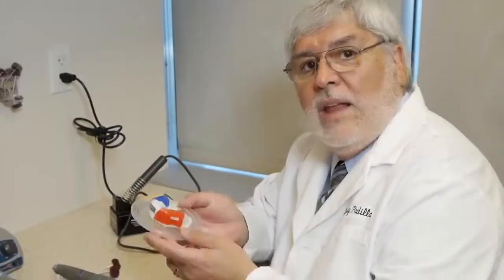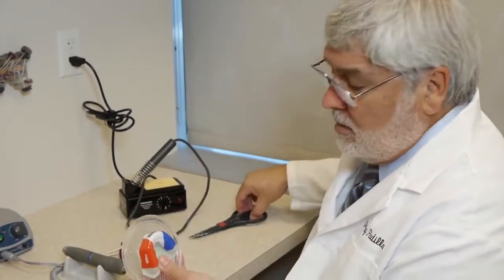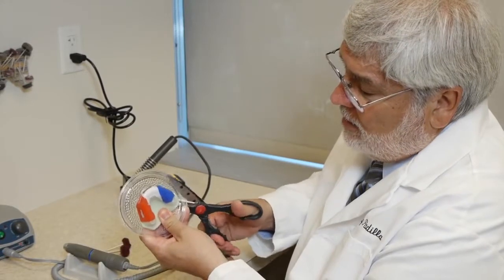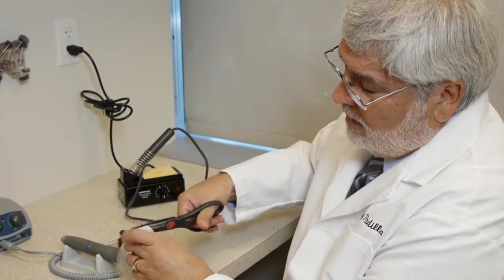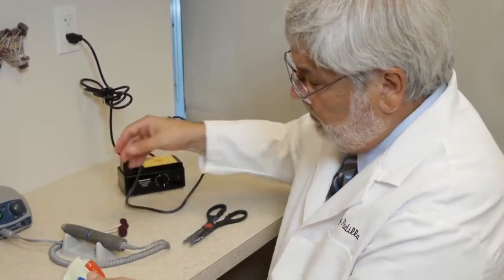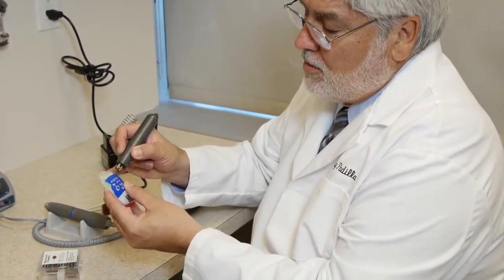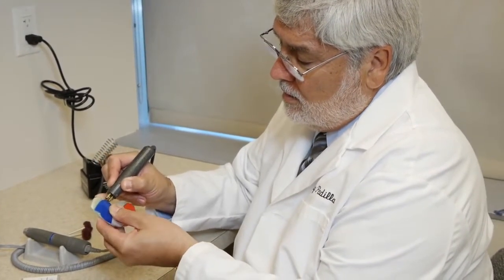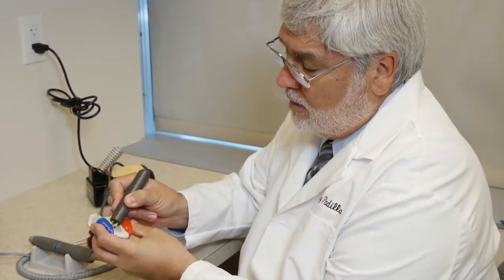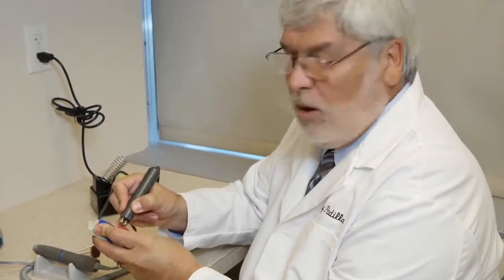Now that our second layer has totally cooled to at least room temperature, we're ready now to complete the mouthguard with the trimming and polishing. So just as we did with the first layer, I'm cutting off the excess material just to give me a little bit of room when I use the hot knife. I'll turn the hot knife on, and then we'll cut the same borders that we cut for our first layer. So I'm going to trim, and you'll notice how quickly this works. The trimming process, start to finish with the second layer, should take well under 5 minutes.